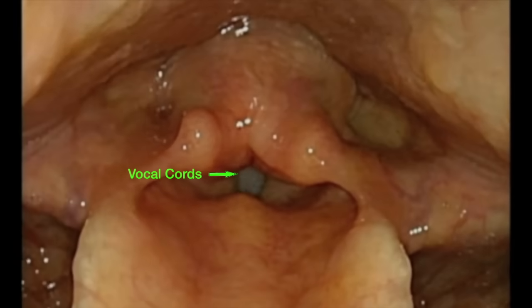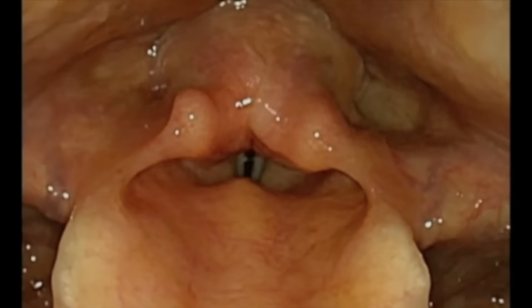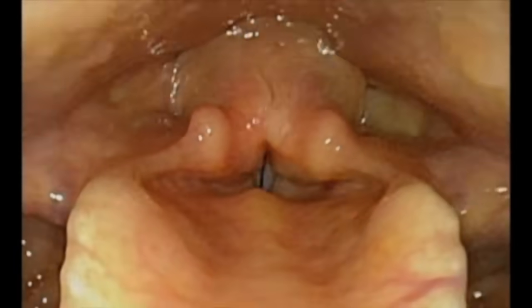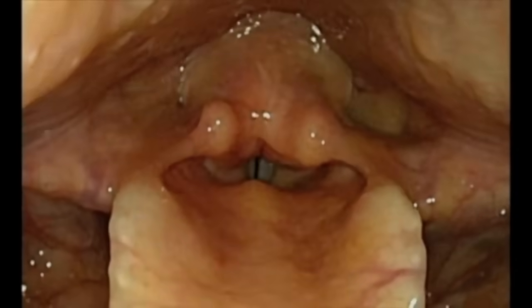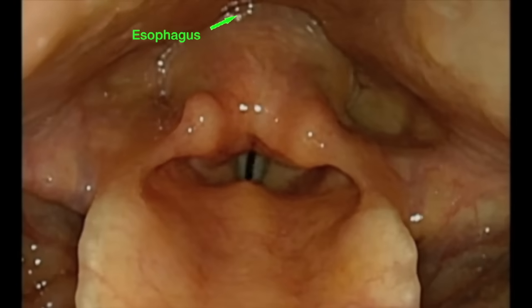In this position, the vocal cords can be seen coming together to create sound. When breathing, the vocal cords move apart in the shape of a V, allowing air to pass between the vocal cords into the windpipe and down into the lungs.